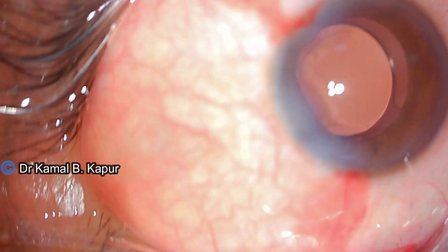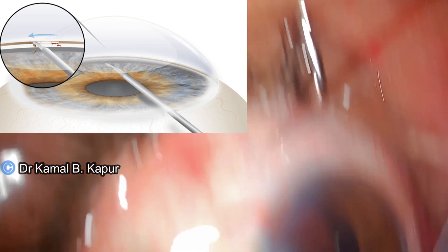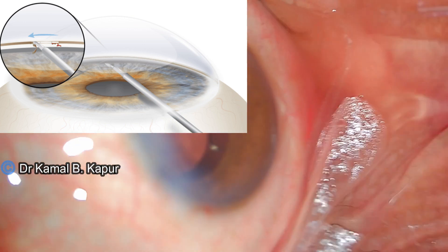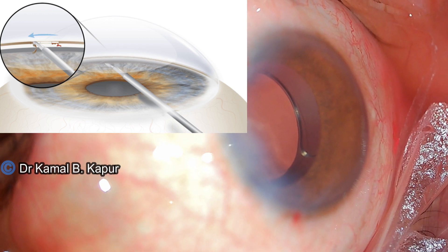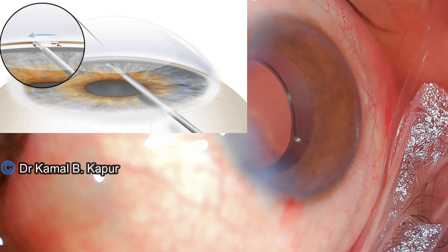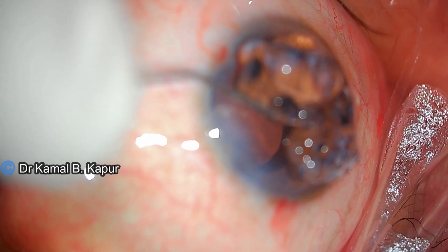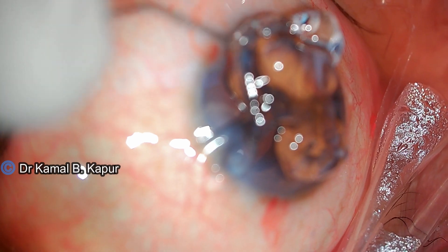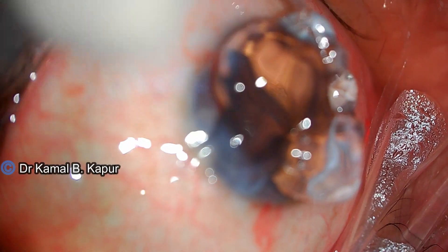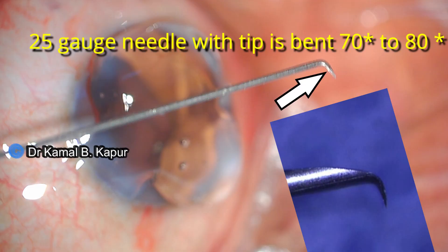Having completed the microscope tilting and patient head tilting, we now put some sodium hyaluronate onto the cornea. We must ensure there are no air bubbles on the cornea, because air bubbles will blur and obstruct the visualization of the trabecular meshwork and impede the view of the angle, potentially causing problems during the MIGS procedure.